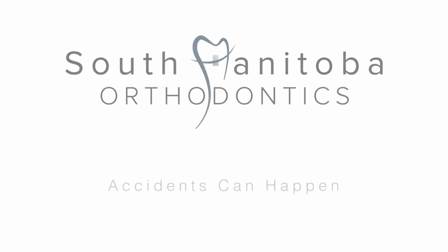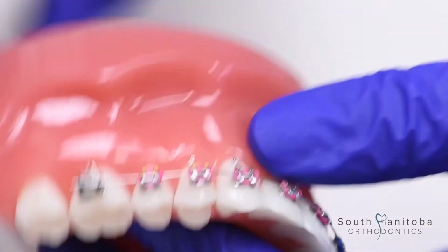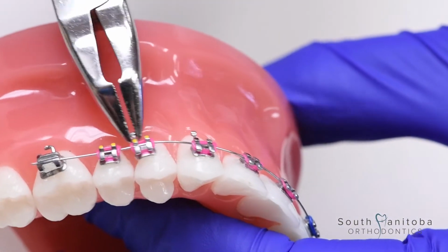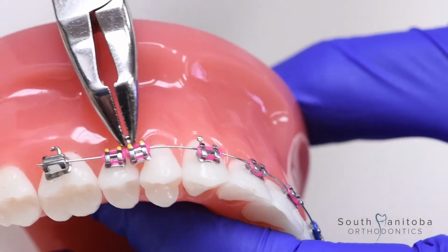Okay, so accidents can and do happen. If at any time you do happen to break a bracket, band, or wire, it's not a big deal or a reason to worry. This usually will not cause any pain or discomfort, so we can put that bracket back on the next time you come in. Please be sure to save any brackets and bring them into your next appointment.